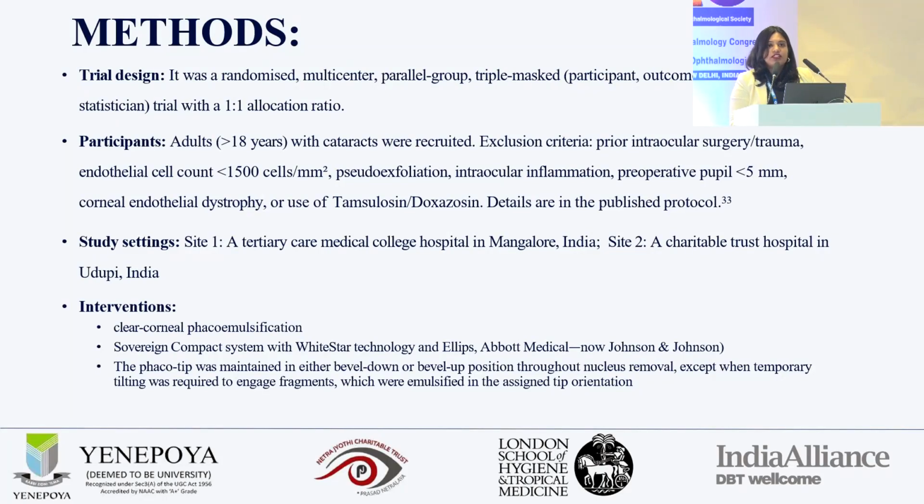The intervention was bevel up or bevel down phacoemulsification with clear corneal incisions. During the nucleus management procedure, the phacotip was kept in the position which they were assigned to. Only in a few cases, the engagement of the fragments was allowed in a tilted position, but the emulsification as such took place in the assigned position.